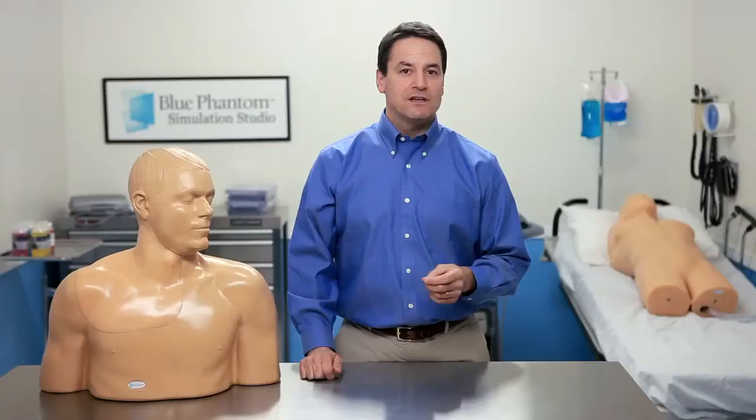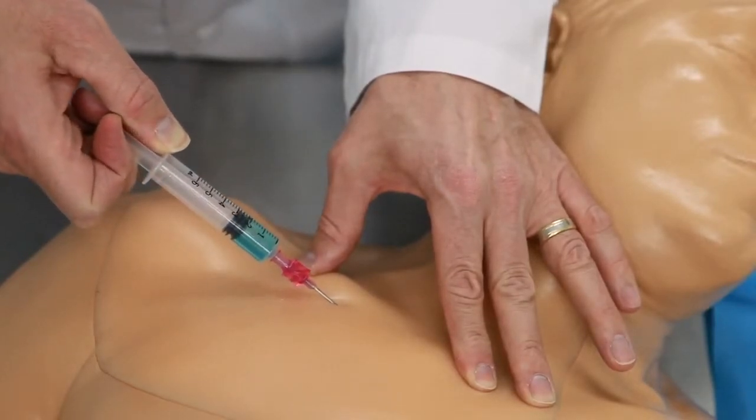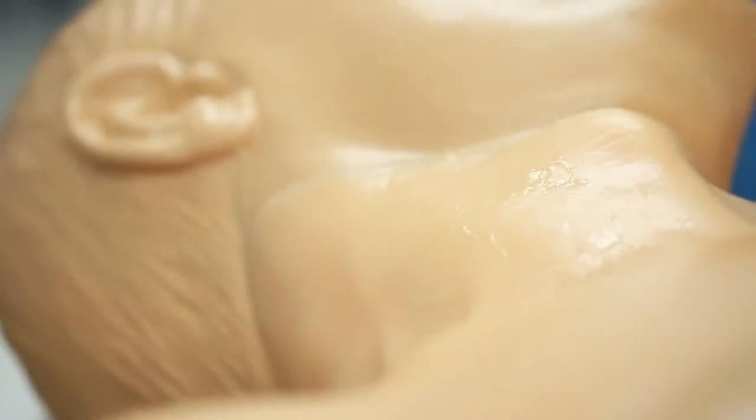Or, as an option, you can add nerves so you can practice regional anesthesia procedures. Whether you're targeting the IJ, subclavian, and axillary vessels, or the brachial plexus, we give you the anatomy you need. The veins are compressible in order to identify the targeted vessels, and we've added the trachea to offer as an internal landmark for regional anesthesia training.